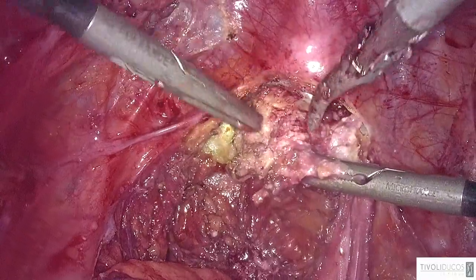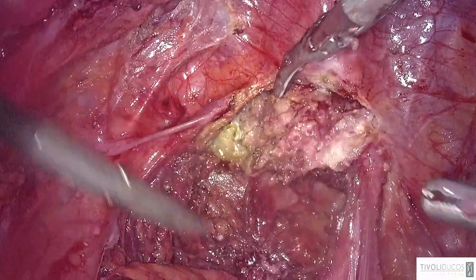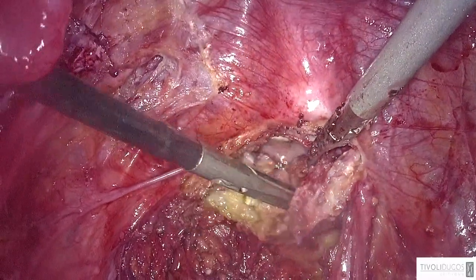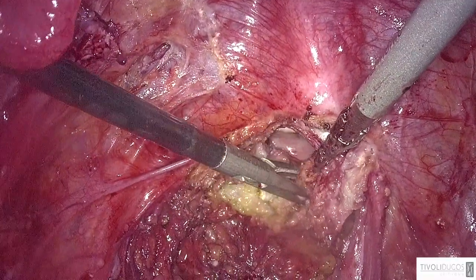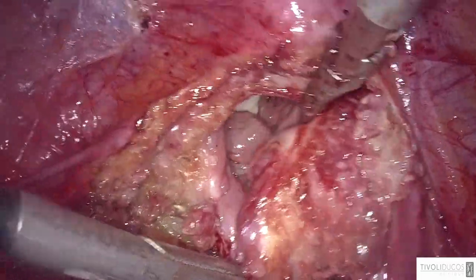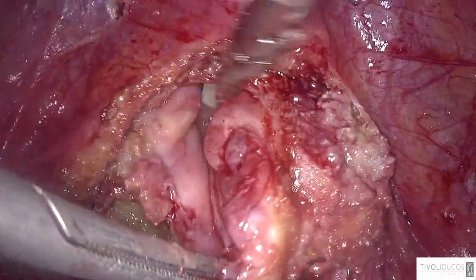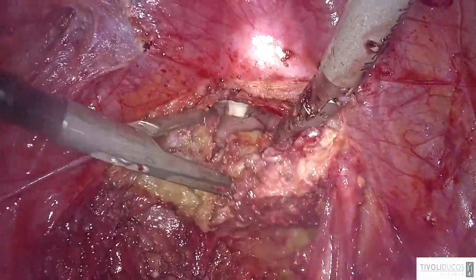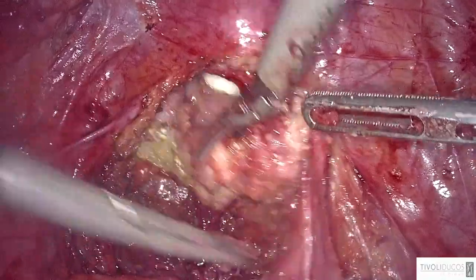No, it's okay. Let it down. So look at the size of the vaginal infiltration. Here, it is a very, very big one. So I scheduled for you a nice rectovaginal nodule.